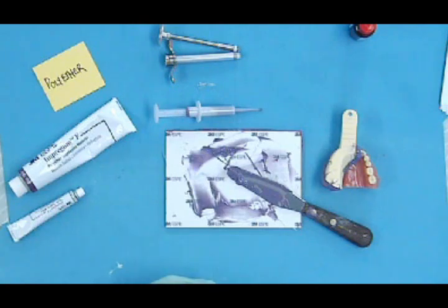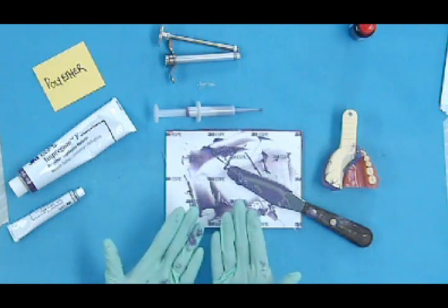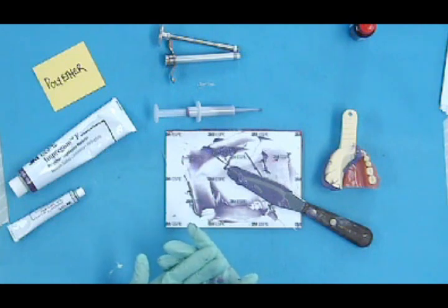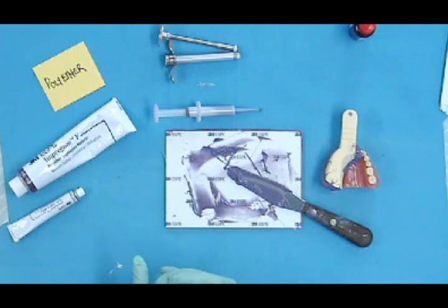Also, we have to be very careful with these impression materials because they will ruin your patient's clothes or your clothes. So you want to always wear gloves, obviously when working in the patient's mouth. But there are some different kinds of barriers other than just the patient napkin that you can put over the patient's clothes when you're taking these final impressions that will give them a little bit more protection. So we'll wait for just a minute until that sets.